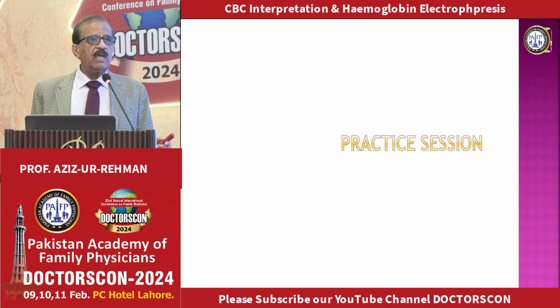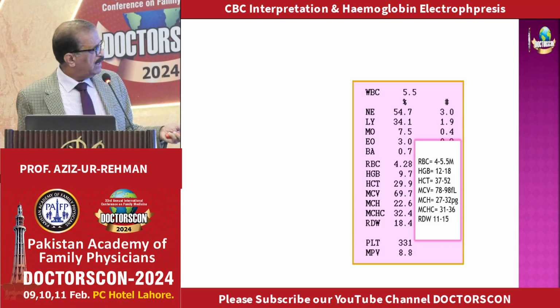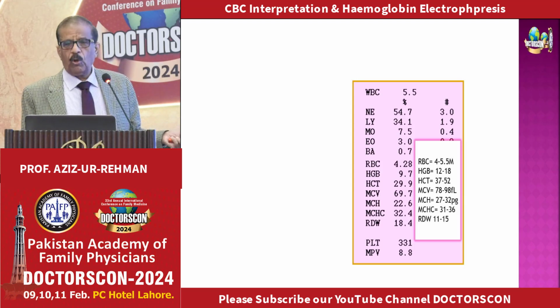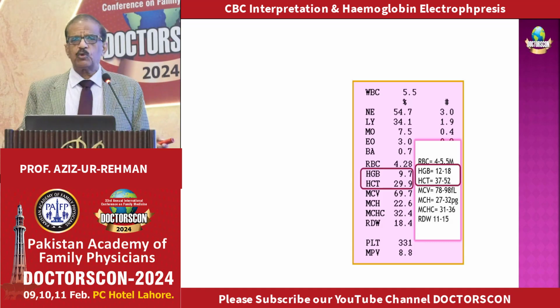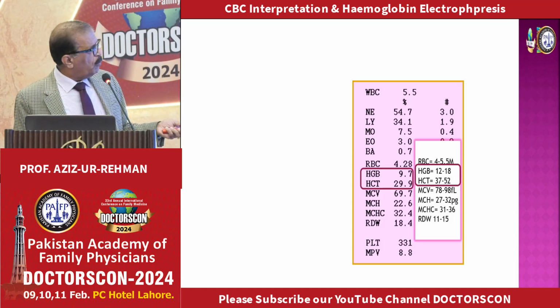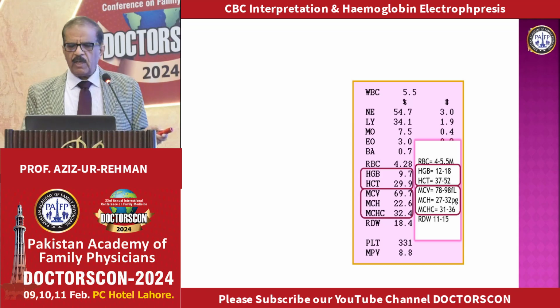I like your engagement. So this is the CBC report. This is the patient report, and here I have inserted the normal. Although a good physician, even a good house physician, would remember these values because these are so often referred to. We normally remember the common reports. So, you can tell the first step. This is the normal range, 12 to 18, and hematocrit 37 to 52. Normally, the ratio of hemoglobin and hematocrit is 3 times.